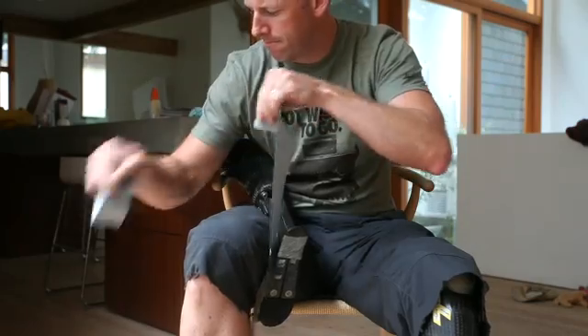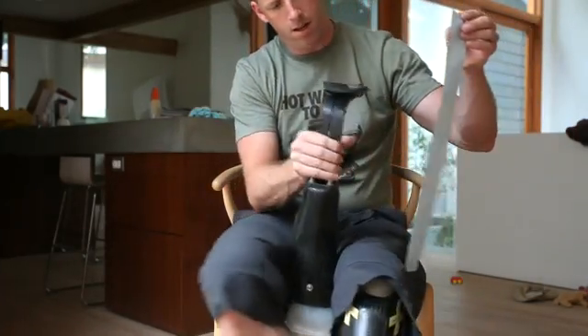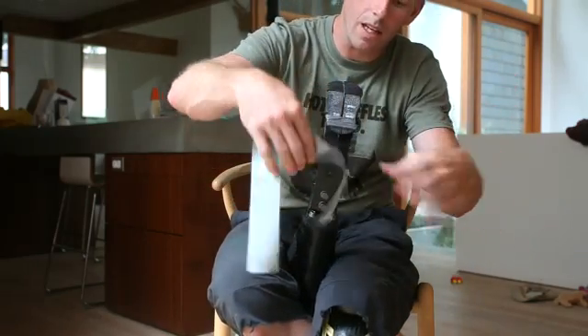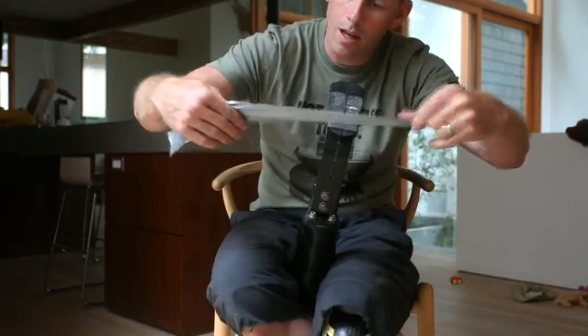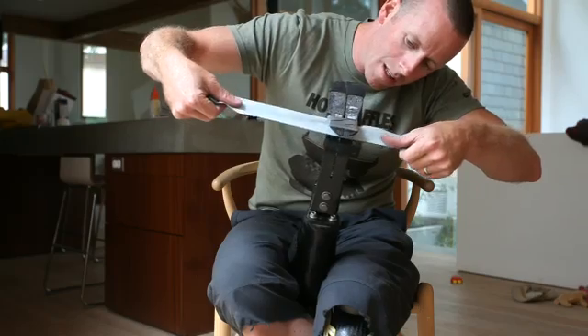This time we're going to get the tape right in here into the spot between the heel carbon and the foot carbon. We're going to slide it in the best we can, bearing in mind that it's sticky.